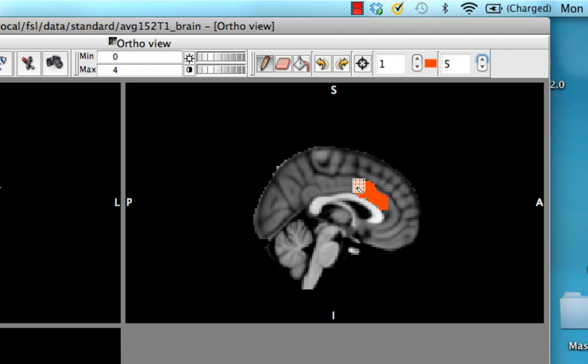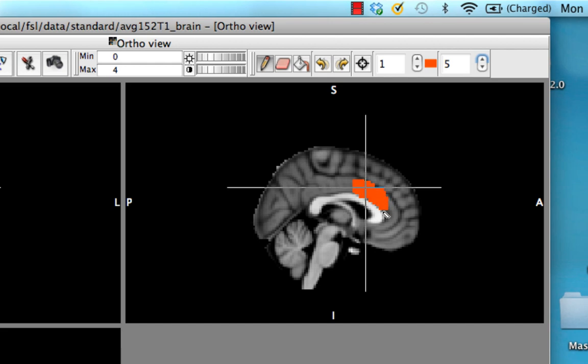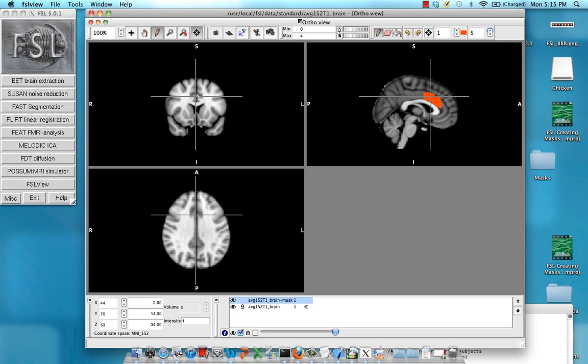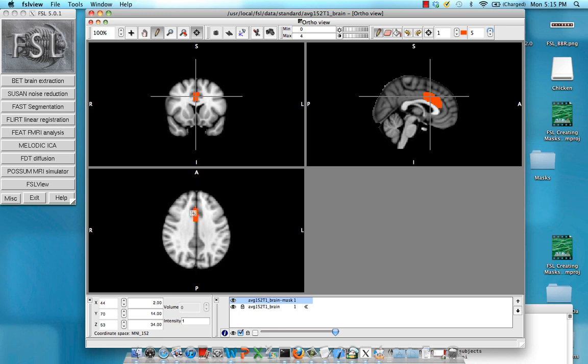Roughly the anterior area. I'm happy with that. All you need to do is make sure you do it within each orthogonal view. Make sure you do it in the coronal section, and in the transverse section.